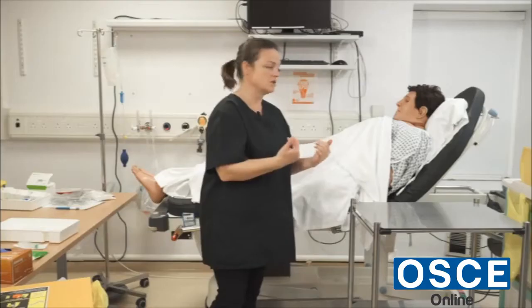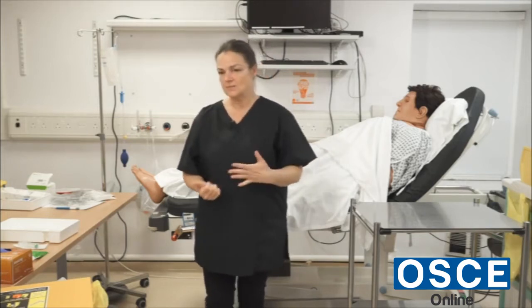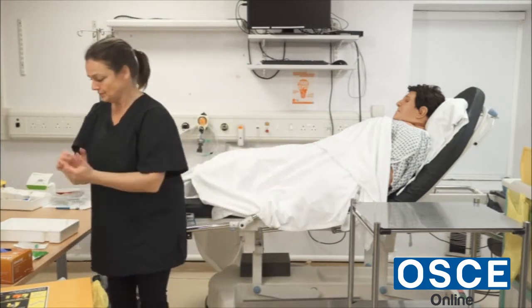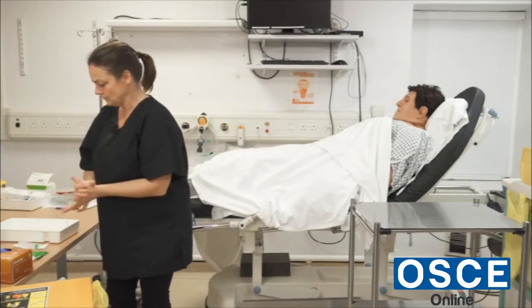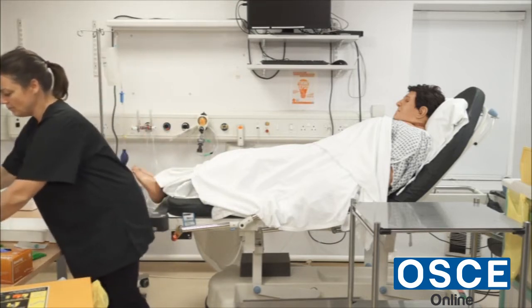I would let the patient know that I'm going to go and collect my equipment for the procedure and I'll be back in a few minutes. I'd leave the patient area, gel my hands again, and don an apron.